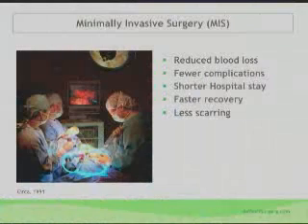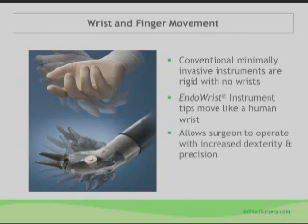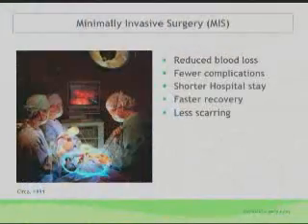The reason why I love the Da Vinci system is a couple of different things. One, we talked about the wristed instruments, okay? You want it to be easy on me. You want me to be very relaxed. You want me to be very, man, this is easy. This is a breeze. You don't want my instruments to be the hindrance to why I can't do what I want to do, okay?